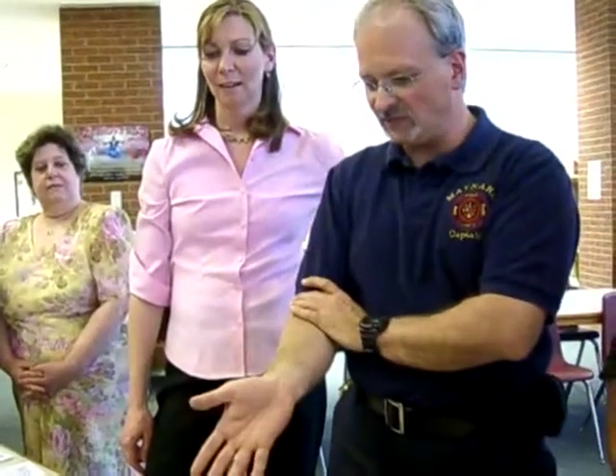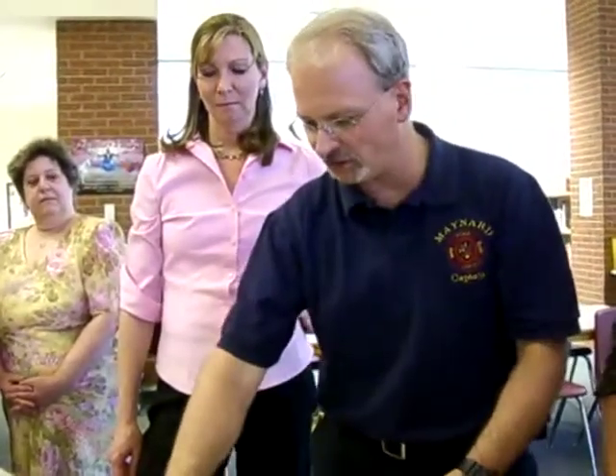Be sure emergency medical services have been called. Start right in on CPR after that. With these particular machines, if you're good at it you can just jump right in and do it. If you're having a tough time remembering, or if people helping you aren't familiar with it, you can push the blue button and the machine will talk you through it.